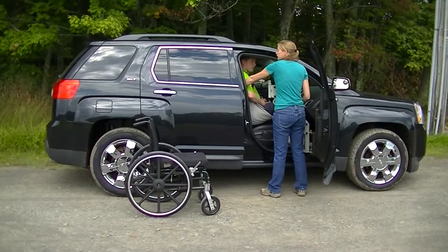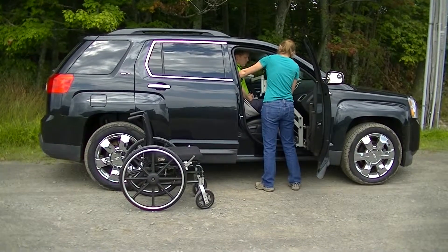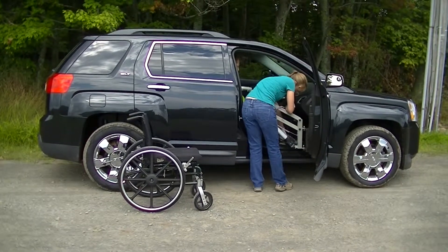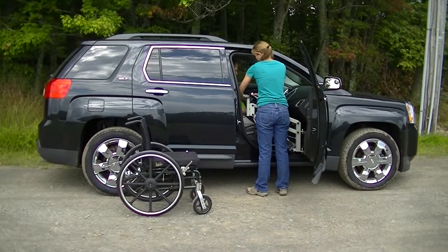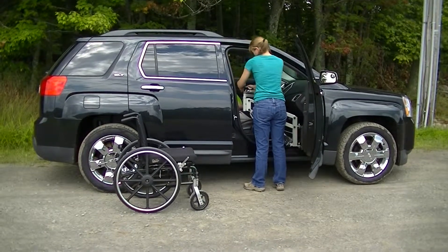To set him up straight, I can either pull back on the sling or push back on his knee. Then disconnect the tabs. I can leave the sling in to get him back out after the ride.